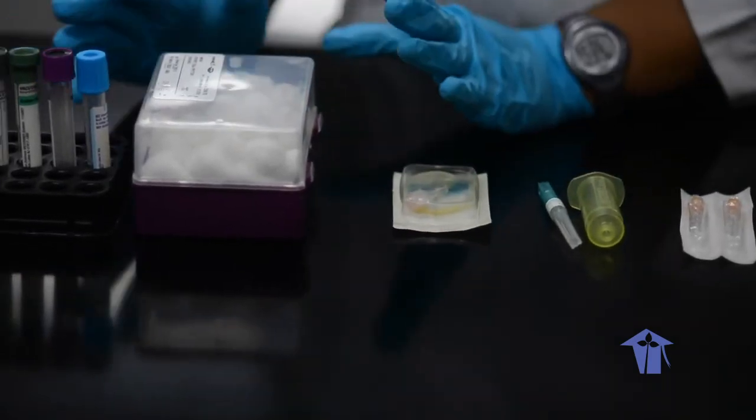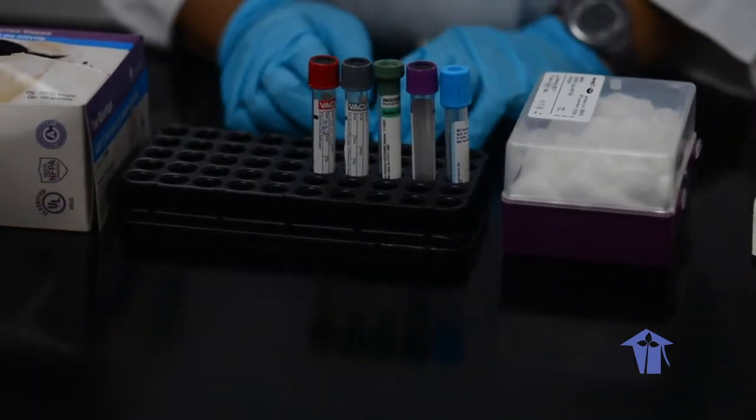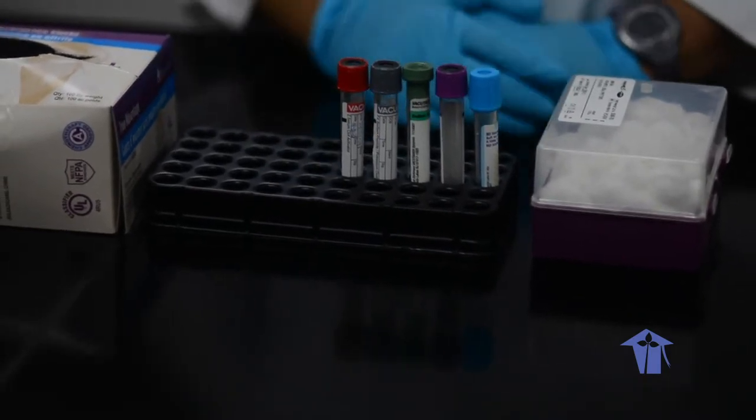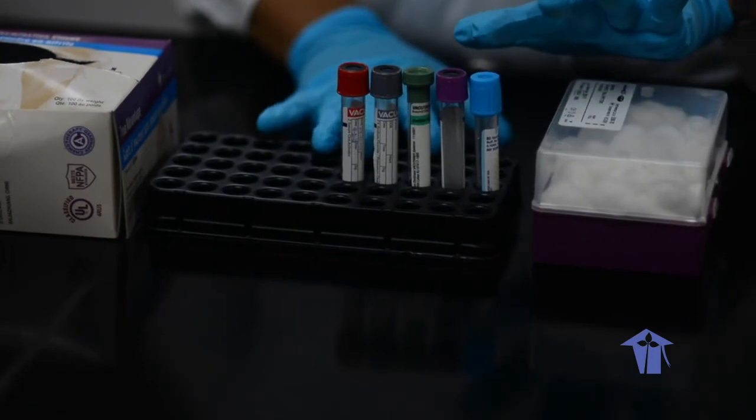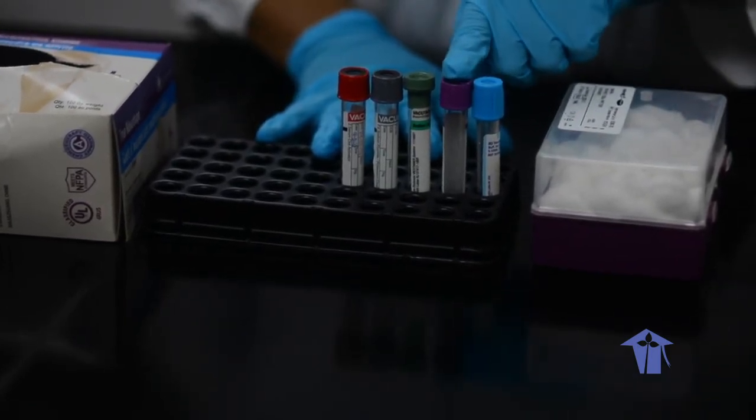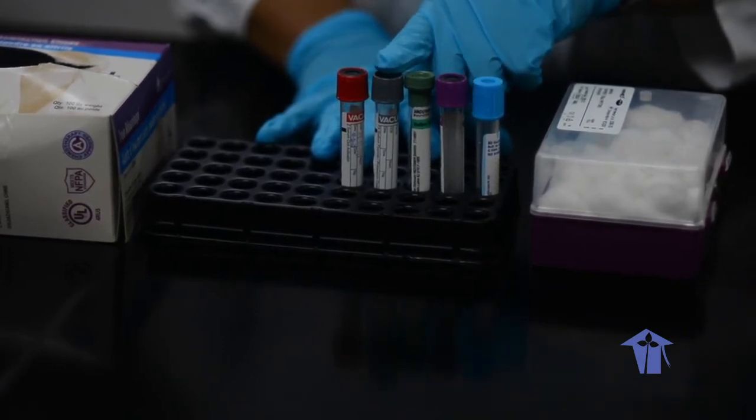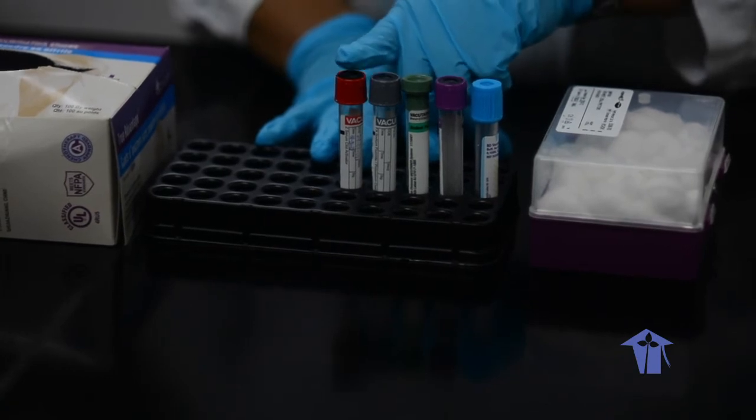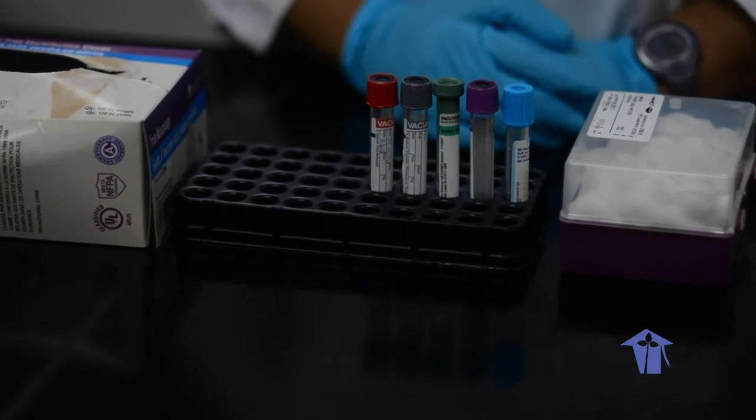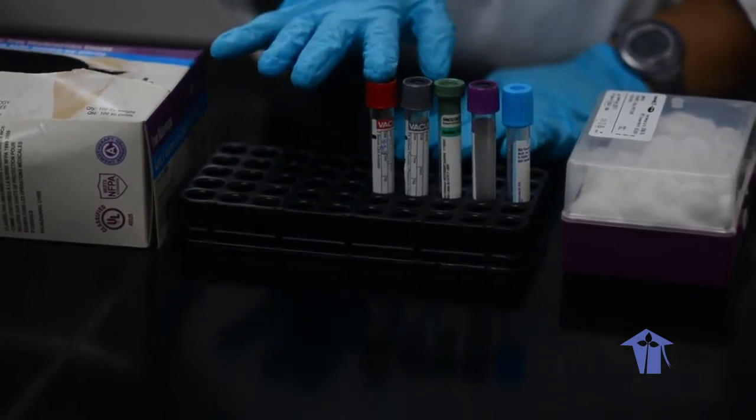We have cotton. We have the actual tubes. So the tubes are color coded. So we have a light blue, we have a purple or lavender, we have a green, we have a gray, and we have a red tube. So each one of these have different anticoagulants in them, with the exception of the red. There's no anticoagulant in the red.